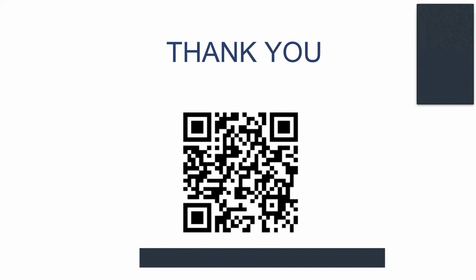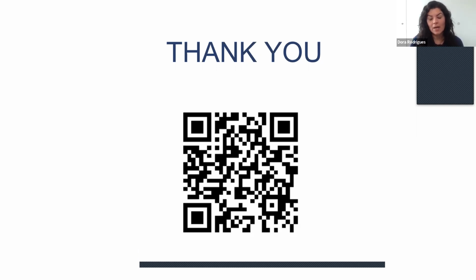So the next question is for Stan. Thank you, Stan, for joining us and for your question. He wants to know, what material are you using for reline? So I don't do denture relines much. I'm not the best person to answer what reline material is best for 3D printed dentures. Oh my goodness.